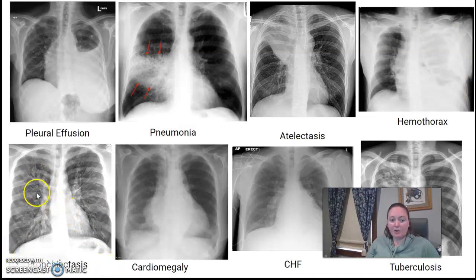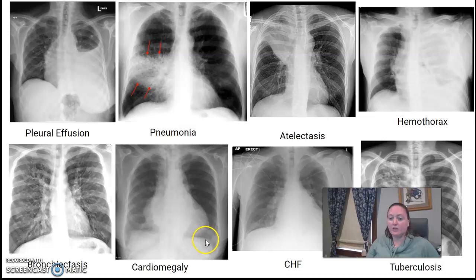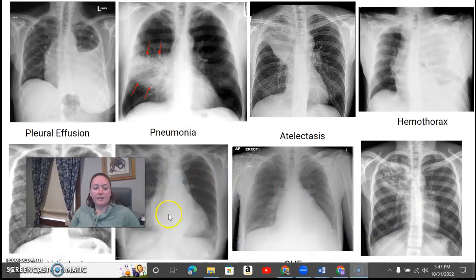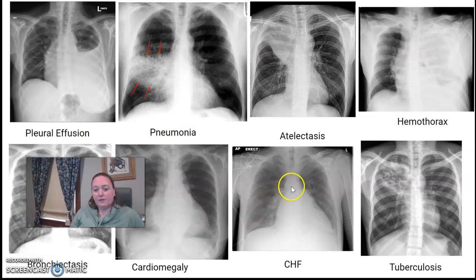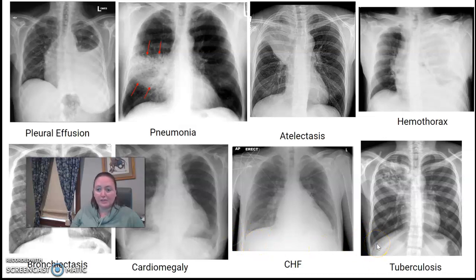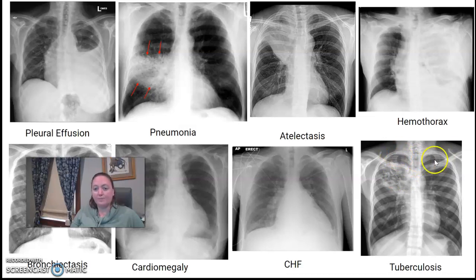With bronchiectasis, you can see the bronchioles have thickened and are more dense. Cardiomegaly — if you look at the size of the heart in this chest, the mediastinum is very wide, coming way out to the side — so enlarged heart. With CHF, there's a failure to pump. The heart is going to look enlarged and we're going to see some fluid collection. The costophrenic angles are starting to be rounded — they're not nice pointy triangles like they're supposed to be. And tuberculosis is going to involve some growths up in the upper area of the lung, which is why we do that lordotic chest view, looking at the apices.